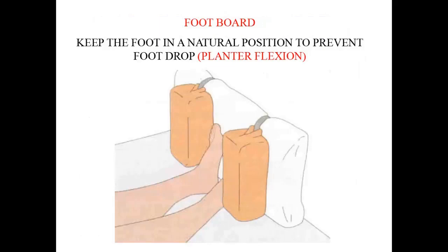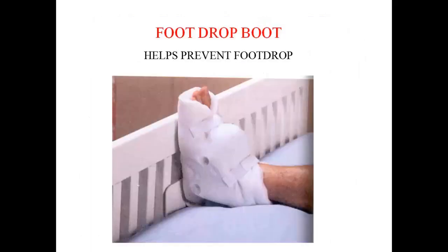Footboard. A footboard helps to keep the foot in natural position to prevent foot drop. Foot drop is where there is a plantar flexion, and in case of fracture or complete bed rest of the patient, this should be prevented. A foot drop boot can also be used. It helps to prevent the foot drop.